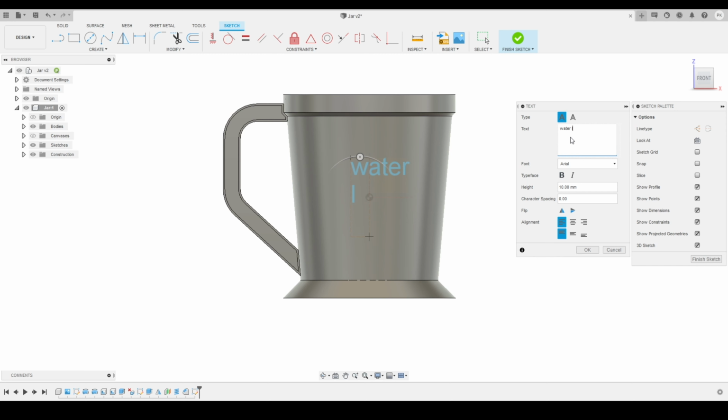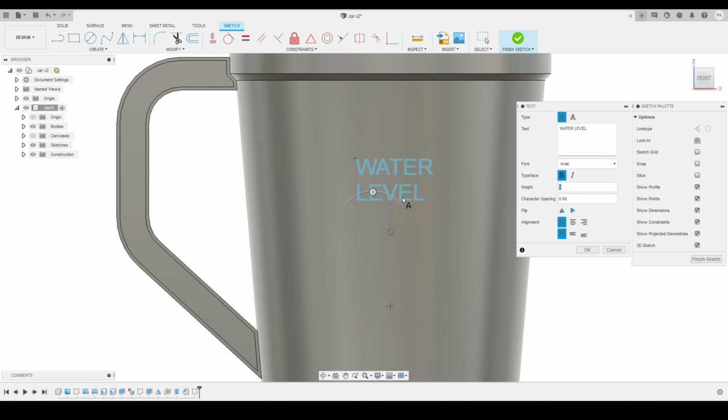So I will just give it a name, water level. Here you can see, and now I got all the settings, like I can adjust the text height over here, and I can also adjust the view of my text. I can adjust the font of my text, so all the details I can adjust and try from here. So I'm just adjusting it a little bit. I'm trying different kinds of fonts and different kinds of orientation. Here you can see I'm just adjusting the text, so it will look like a water level kind of text. So I'm changing that to a vertical orientation just by pressing enter after each alphabet.